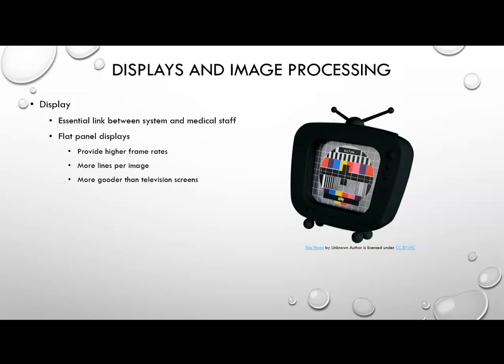Today's systems utilize what's known as a flat panel display. These displays are built upon the old technology of television screens, but utilize modern digital modalities to do that.